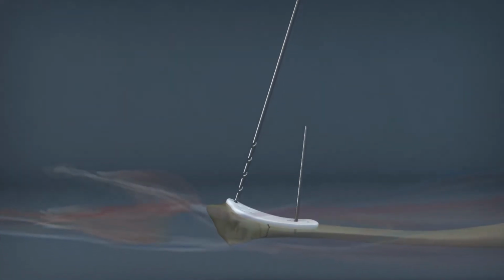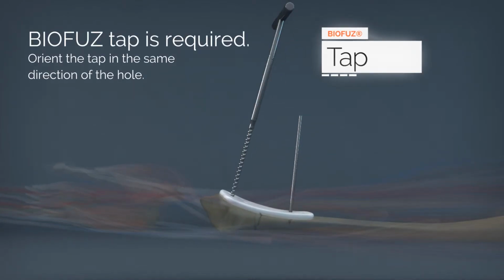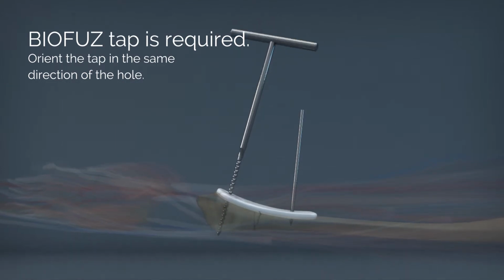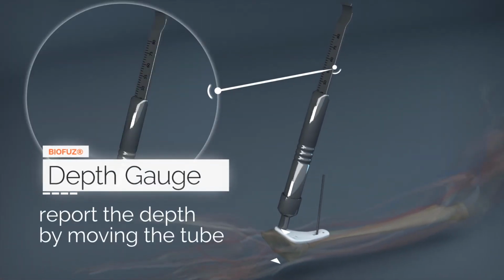Drill a transcortical hole. Tapping is required. Orient the tap in the same axis of the drilled hole. Tapping must be done until the second cortical in case of healthy bone or just after the first cortical in case of brittle bone. Size the depth of the hole.